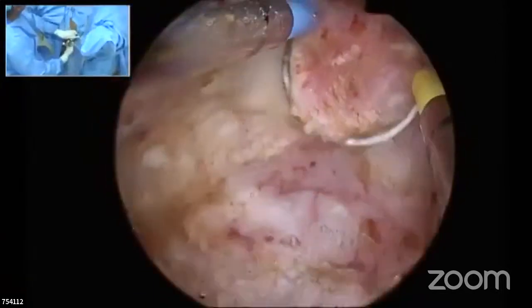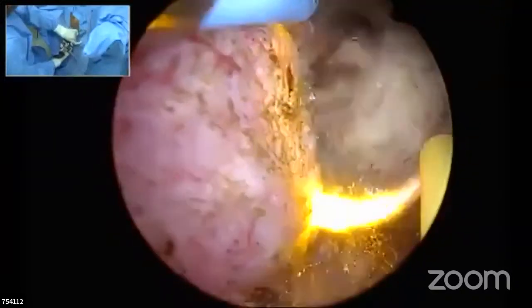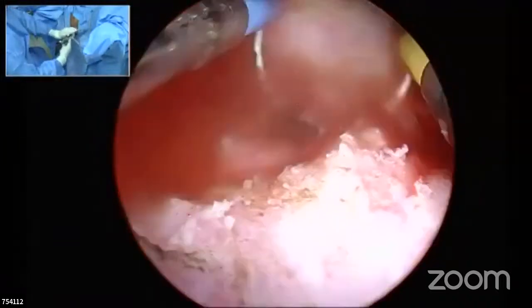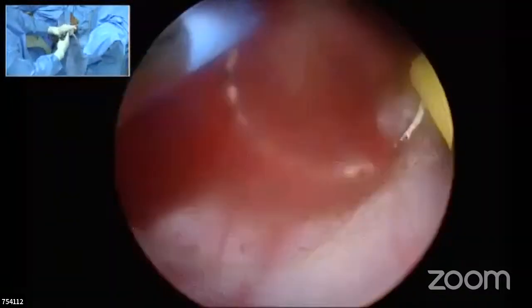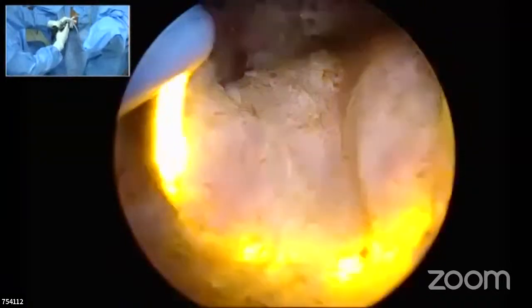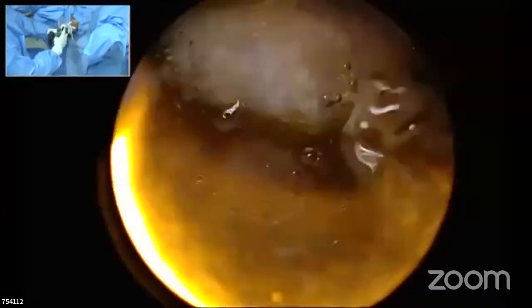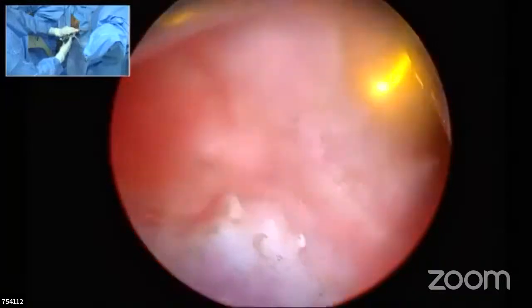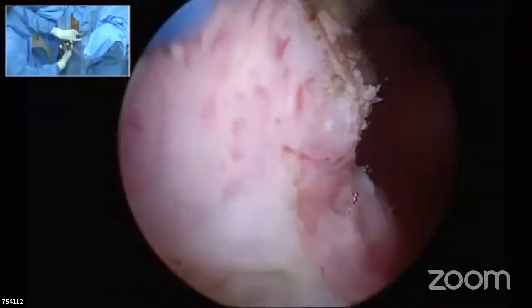So I would say, once you resect and come to the groove, come to the capsule on the periphery, you understand what is the lobe which is projecting into the bladder. You know what is this, and then you start resecting it right then and there itself and flatten the surface of it till the area where you have resected. So this is my small modification which I always teach the people. You will be reaching the capsule. Don't be in a hurry, right to the bottom, and then you go back again.